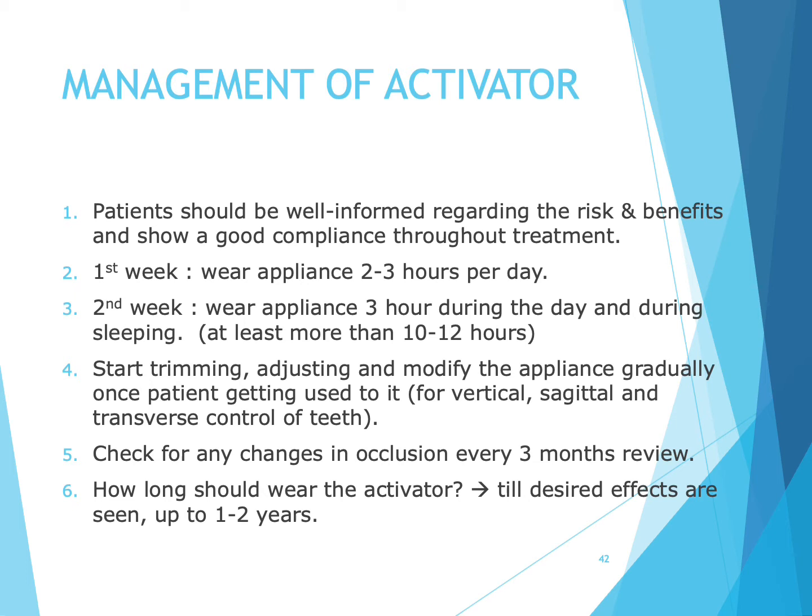So now, what is the management of the activator? Patients should be well informed regarding the risks and benefits and show good compliance throughout treatment. For the first week, the patient needs to wear the appliance for 2 to 3 hours per day, and for the second week, 3 hours during the day and during sleeping. So the total timing should be at least 10 to 12 hours during the day and sleeping.